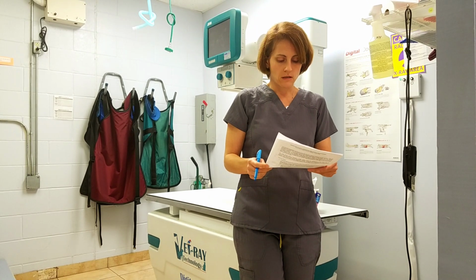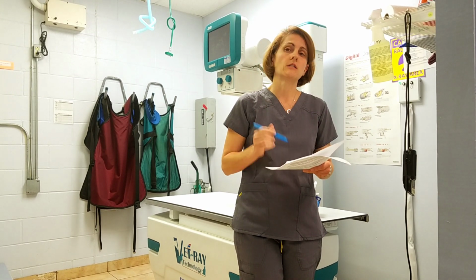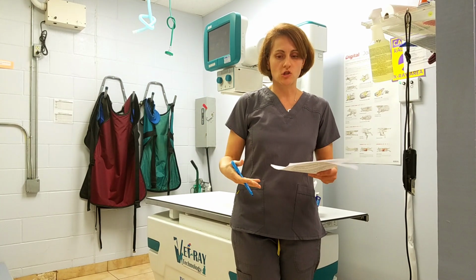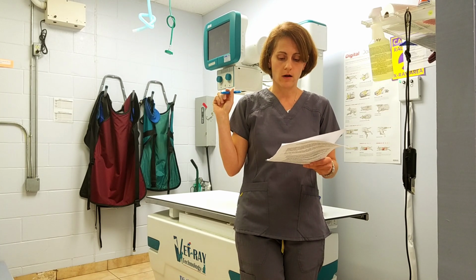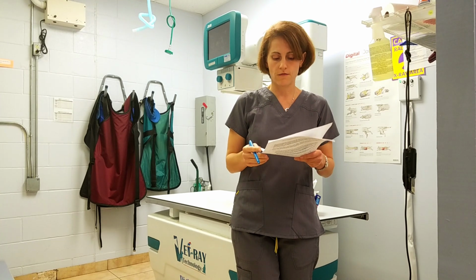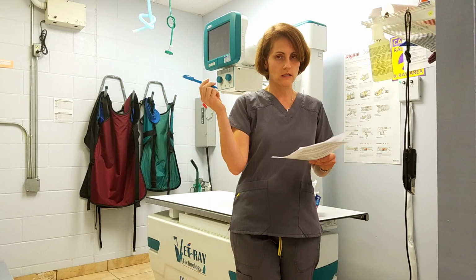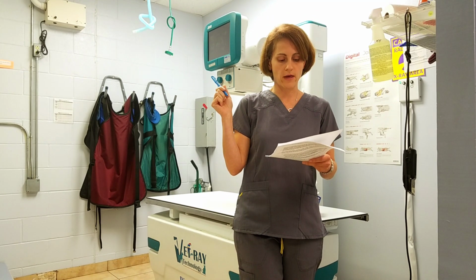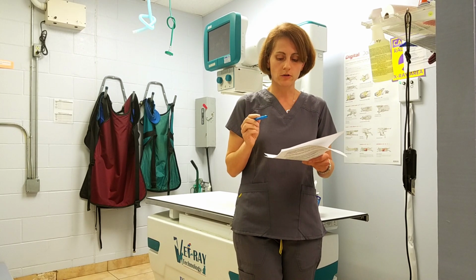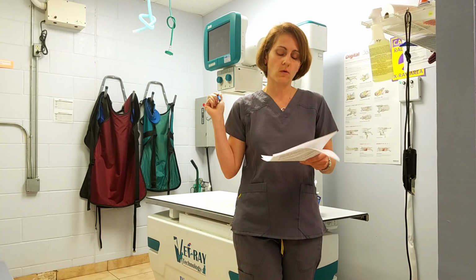Digital imaging acquisition systems, we're on to number 6. We use a digital imaging acquisition system. That means both our dental and our regular x-ray system. The images are stored digitally, so they're not on film. They are on the computer. So the protocol on how we maintain the quality of the films is also in the state radiology binder. If you ever want to take a look at that, that binder lives in the veterinarian's office. I will show you in just a minute where that's located. The inventory list is maintained by Courtney Lovell, and it also lives in that state radiation binder.